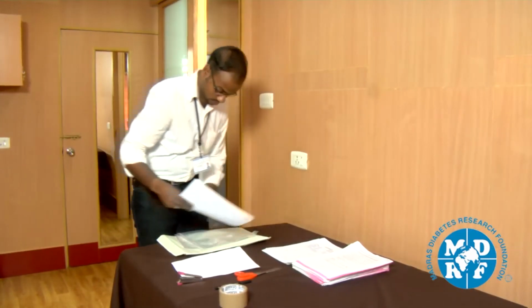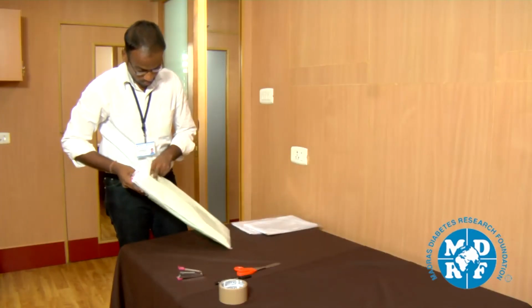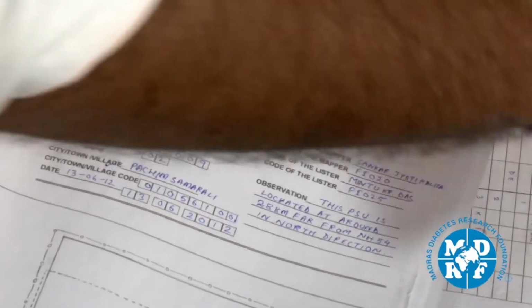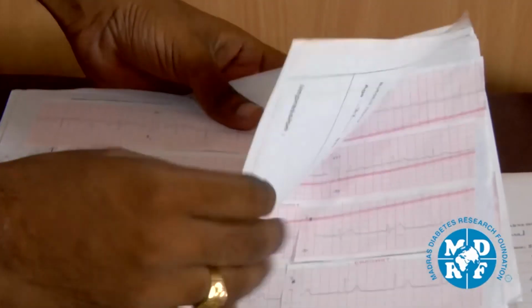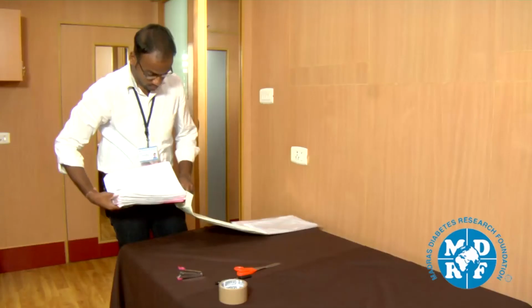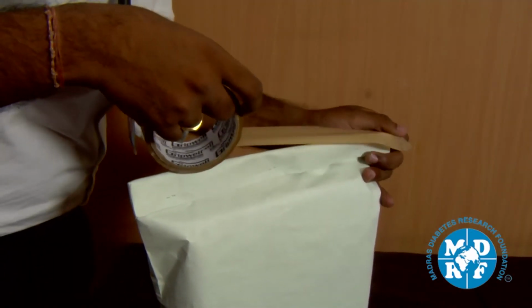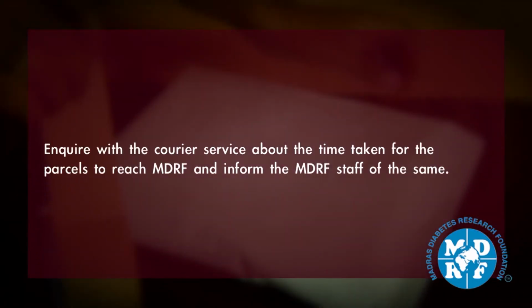Then place the details of the collected samples in a Ziploc cover and place it inside the package to be couriered. In addition, place the completed questionnaires, white and blue, location map, structure map, log sheets and ECG rolls in separate folders, which are packed separately as paper documents. Pack them properly, seal with sellotape and courier them along with blood samples. Enquire with the courier service about the time taken for the parcels to reach MDRF and inform the MDRF staff of the same.